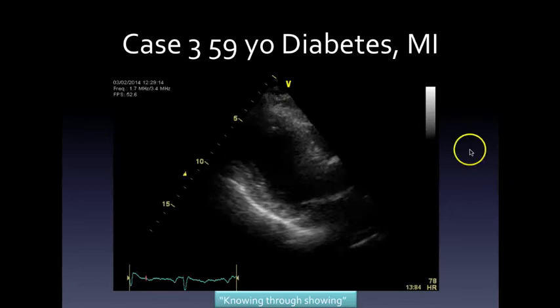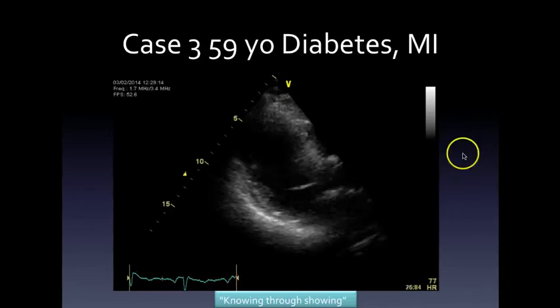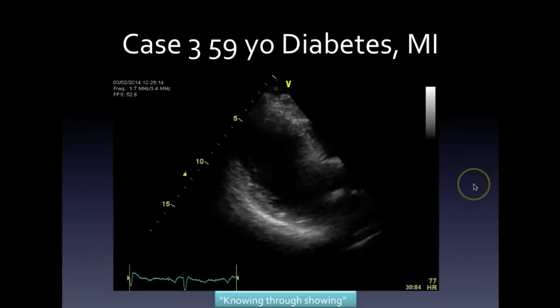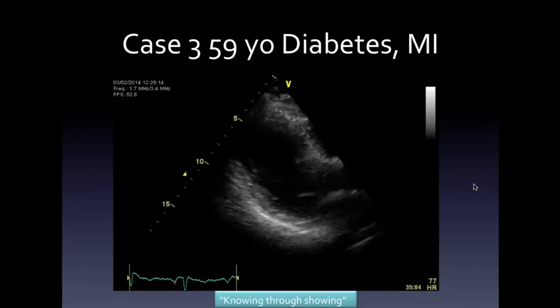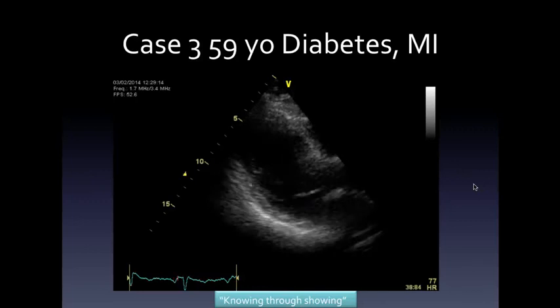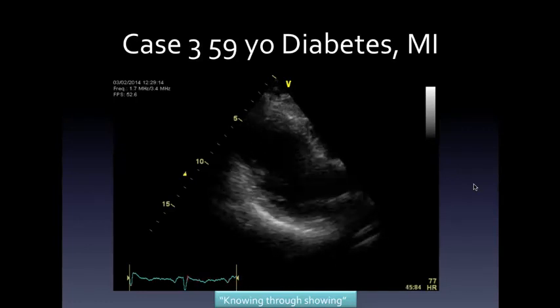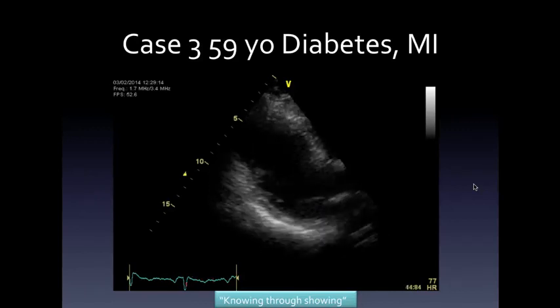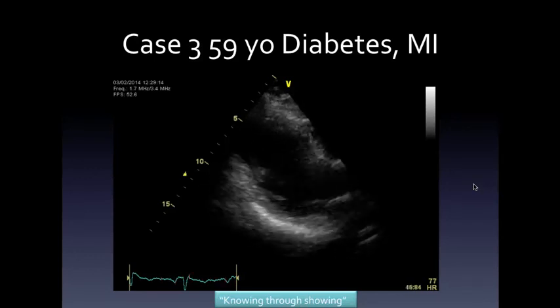But if you look at this fractional shortening here, in this view, this is vigorous contractility, which of course is exactly what happens. If you get a regional wall function abnormality, the other portions will all bail in to give a hand. So what you get is hypercontractility in the non-infarcted area. Why do you get that? Sometimes it's because the patient is on an inotrope, which this man isn't. But of course, it's the inotrope the body produces, the profound sympathetic catecholamine outpouring in the acute patient, so that the patient is on his own adrenaline infusion, which is why for a day or two they seem good, and then suddenly they crash and they need the inotropes.